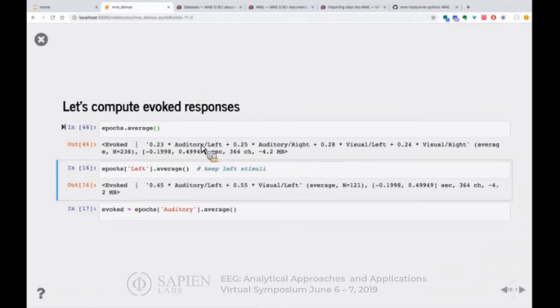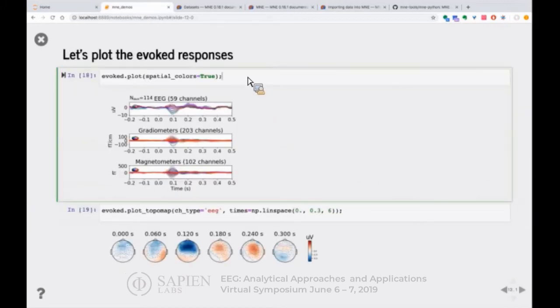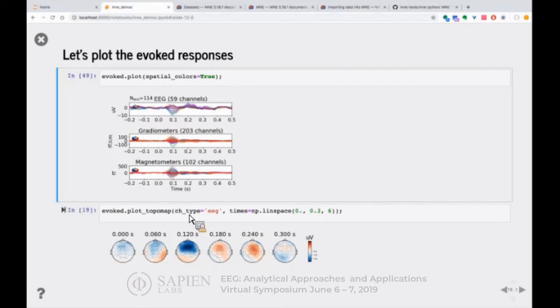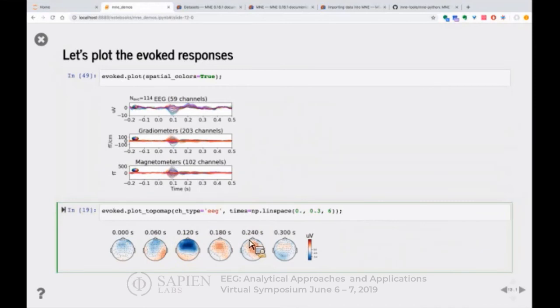Let me move on to show you how to compute evoked responses or event-related fields or event-related potentials if you do EEG. Here I'm going to blindly average all my epochs. This gives me the evoked response where this evoked is a mix of auditory left and everything. There's something quite neat you can do. Since this event ID is coded with a slash, the slash separates between tags. I can say epochs square bracket left, and this will take all the epochs that correspond to a left tag. So auditory left will survive and visual left will survive. I'm going to do the same thing for auditory, taking all the auditory responses whether they are left or right.